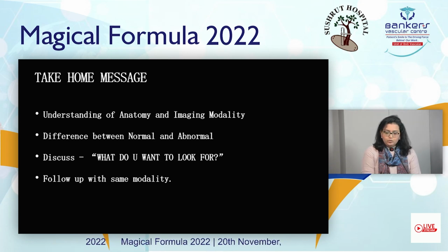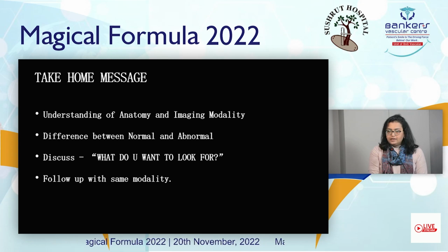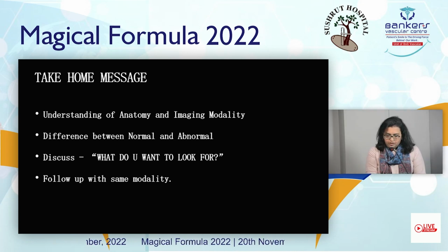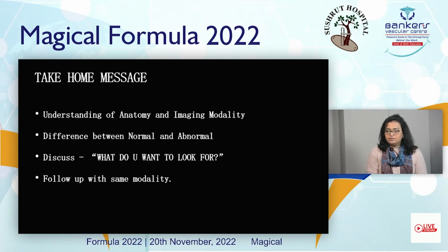So the take-home message is that you need to understand the anatomy and the imaging modalities for evaluation of plantar fasciitis. There is a difference between normal and abnormal, and comparing it with the contralateral side, especially on ultrasound, helps. And you can follow up after an intervention or physical therapy to see how the response is on ultrasound. Thank you.